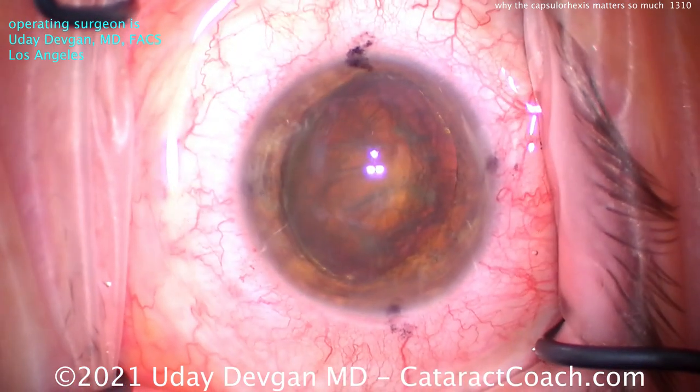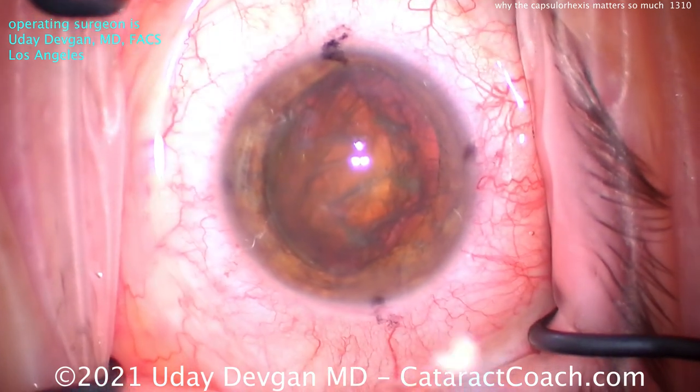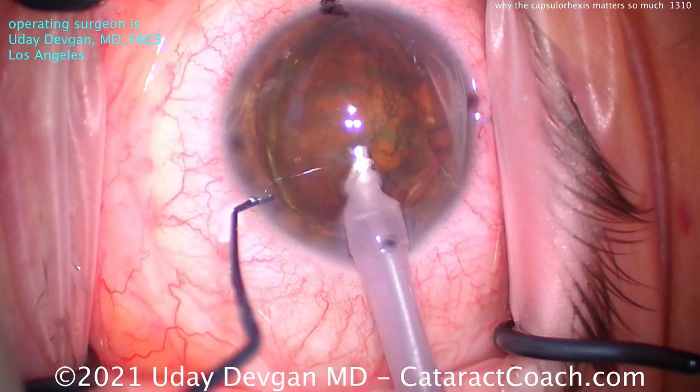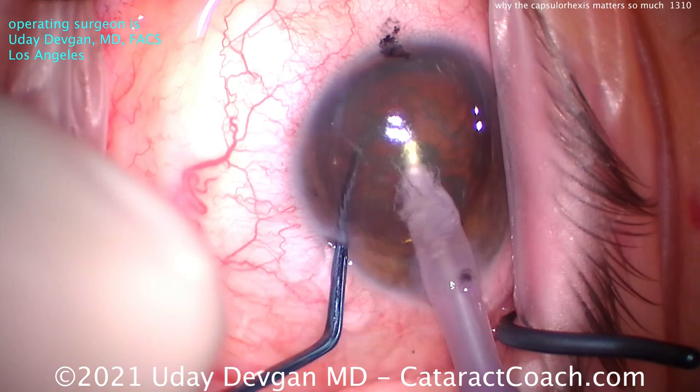Look at that — we just prolapse it up. So the rhexis is 5 or 5.5 millimeters in diameter, and that nucleus is about 9 millimeters in diameter. The nucleus is relatively soft, and the capsule tissue is relatively elastic, so we can get it up. There's a strength that's really important.